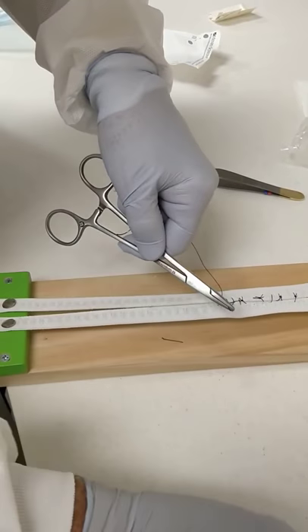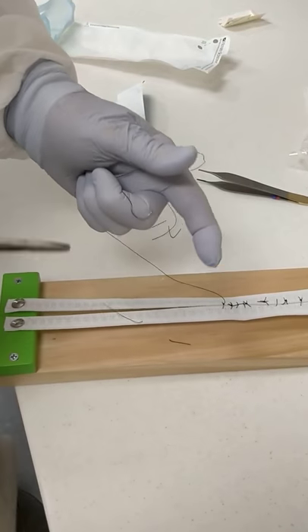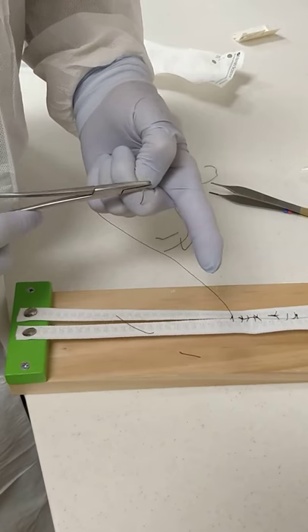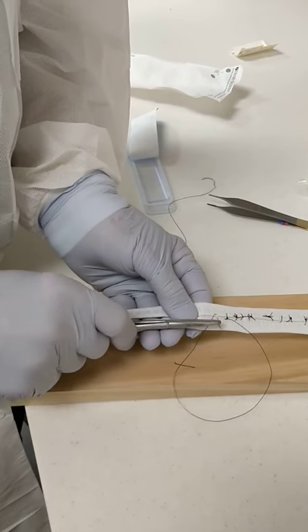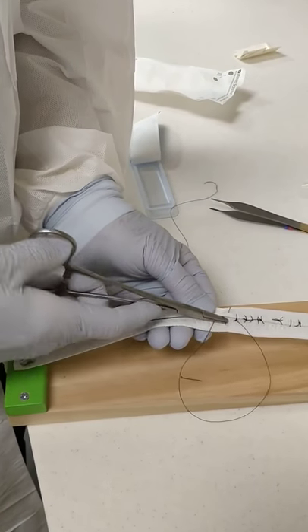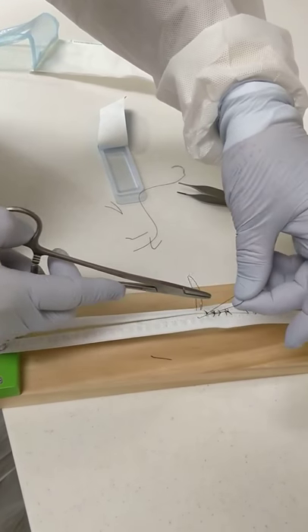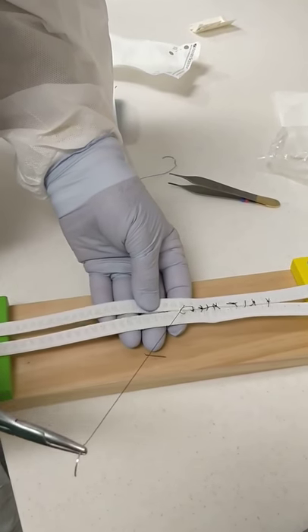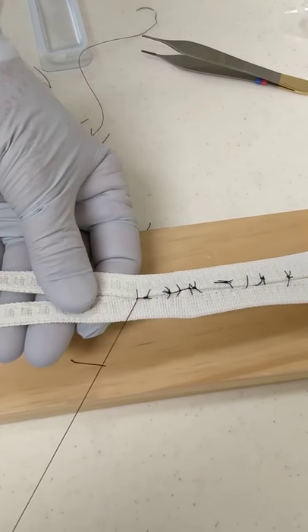Tie that, cut the short end, and this is exactly the same as the locking, except that you don't lock it. So instead of twisting it, you just push it back through straight, and you can see the difference, as this comes down, it doesn't snug up on itself.